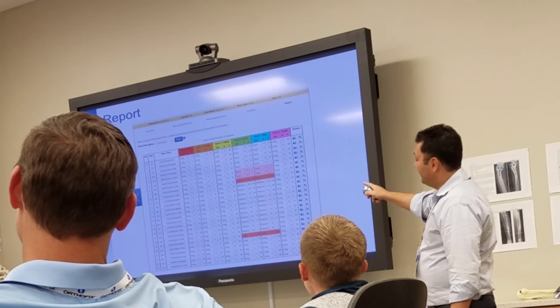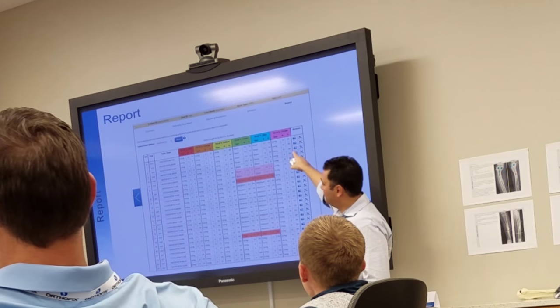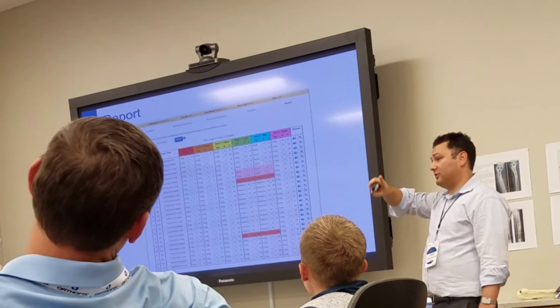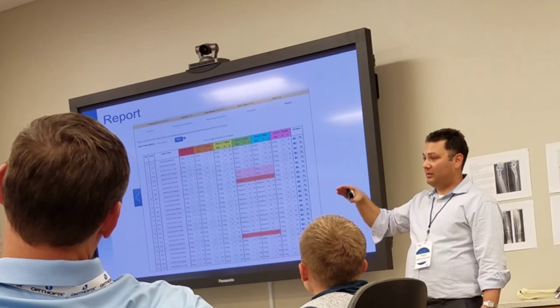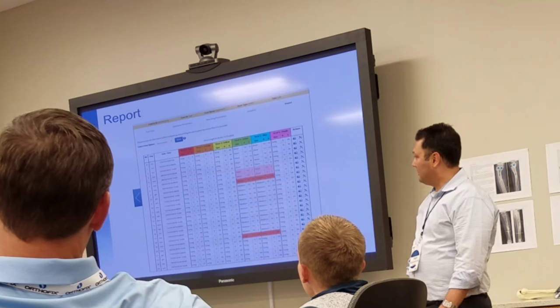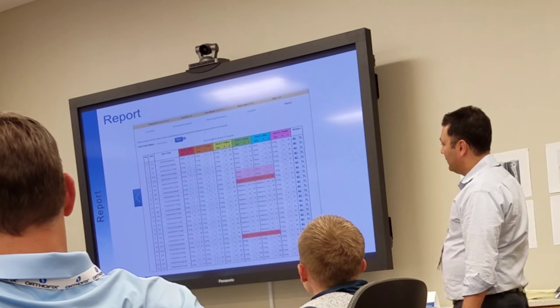If you click on one of these boxes, there's an arrow you can click through and it will actually slowly show the Equinus coming up. If you have a quick internet connection, it'll jump from picture to picture and the patient can see that as well.